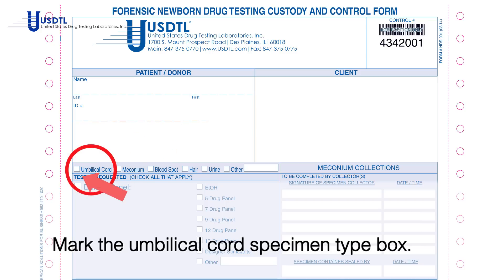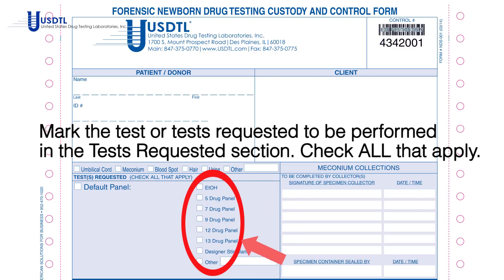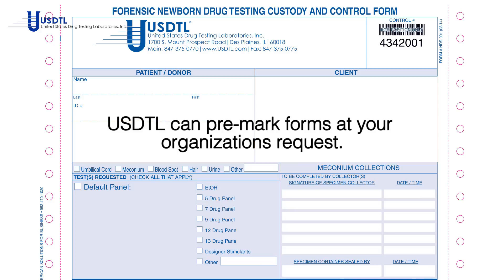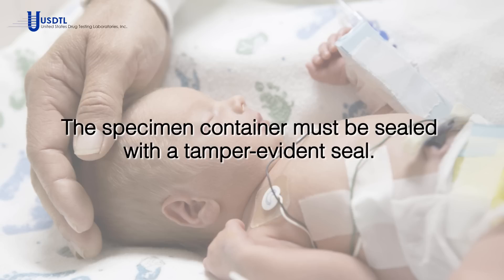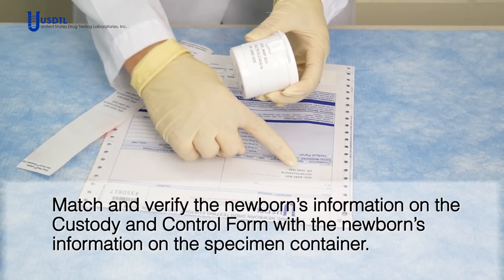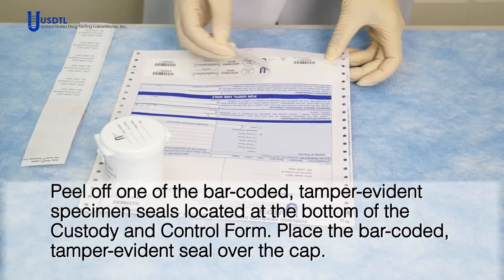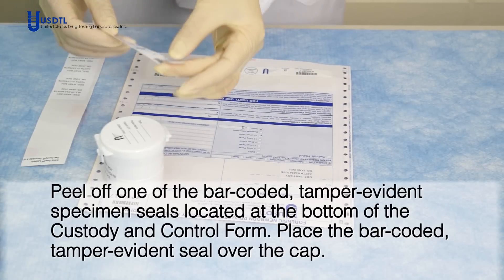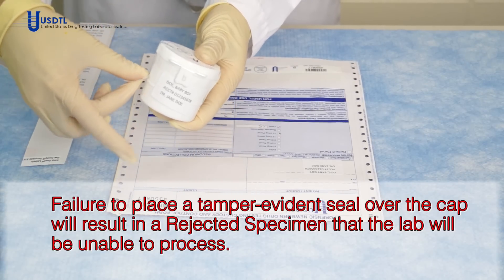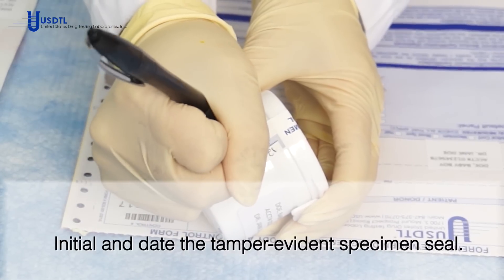Mark the umbilical cord specimen type box. Mark the test or tests requested in the tests requested section — check all that apply. USDTL can pre-mark forms at your organization's request. The specimen container must be sealed with a tamper evidence seal. Match and verify the newborn's information on the custody and control form with the information on the specimen container. Peel off one of the bar-coded tamper evidence specimen seals located at the bottom of the custody and control form and place it over the cap. Failure to place a tamper evidence seal over the cap will result in a rejected specimen that the lab will be unable to process.